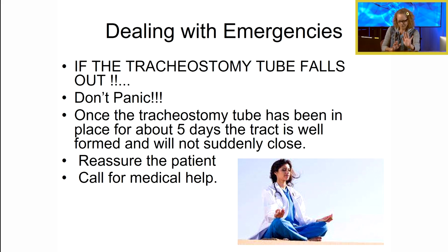However, we still have a medical emergency on our hands, right? So it's important for you to know that if that trach has been in there at least 5 days, that airway is probably going to still be open even if the trach comes out. It's almost like when you get your ear pierced, right? The hole's still there, even when you take your earring out, right? Now, is it 5 days for everybody?